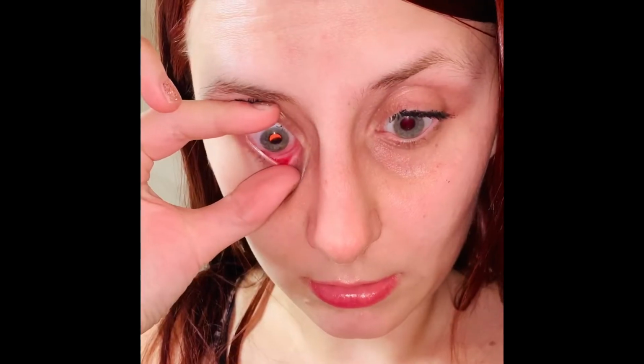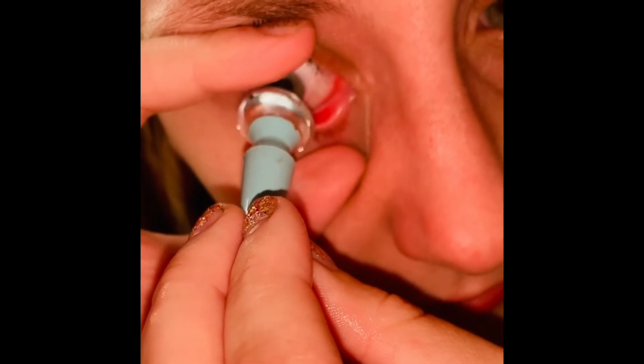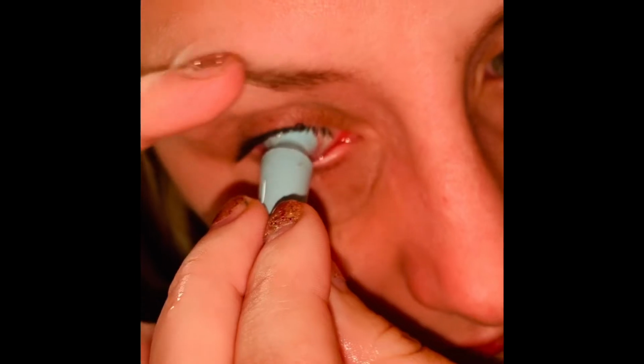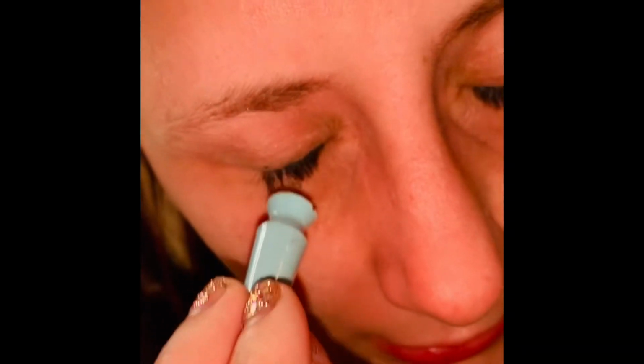Then you want to tilt your head down and open your eye as big as you can get it. And then you want to go into the lens with your eye. And go, go, go until your eyeball stops. Blink. And then you should be good to go. And check for air bubbles.